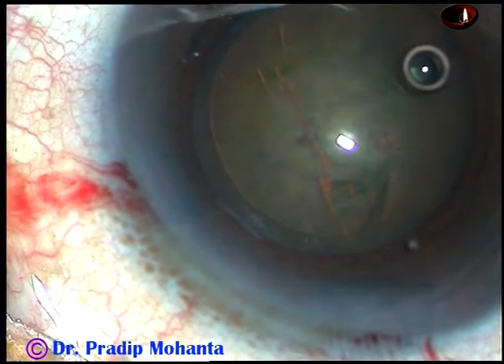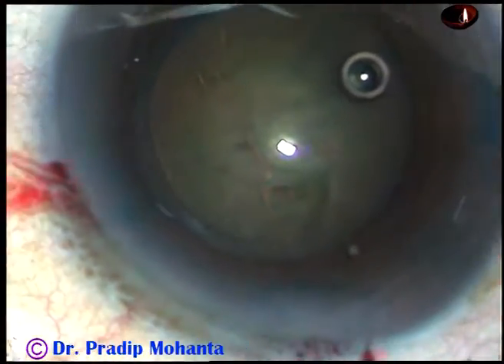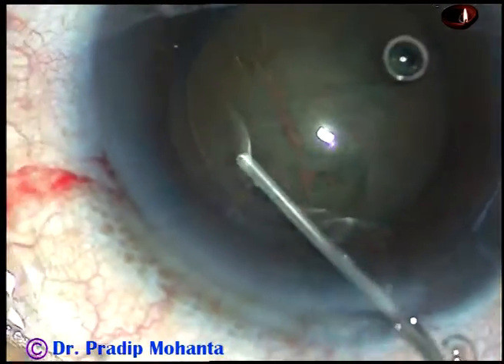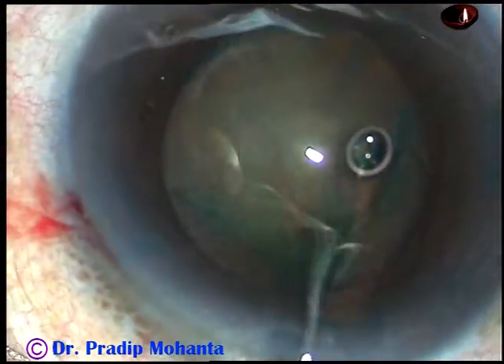And now hydrodissection is to be done. BSS is passed just under the anterior capsular rim and at this time we must see the fluid wave going from one side to the opposite side. Here it is. Yes, now the nucleus is elevated and rotated.